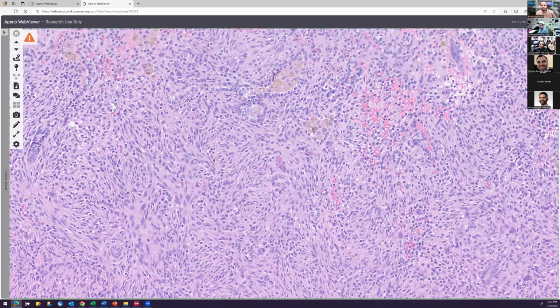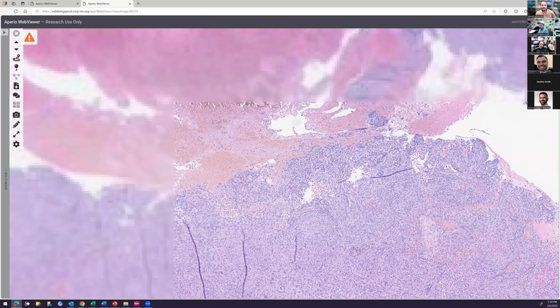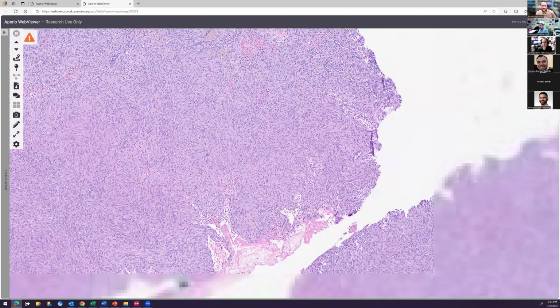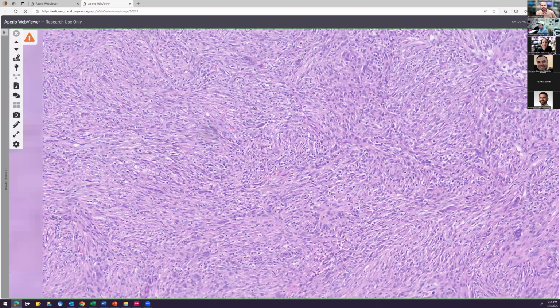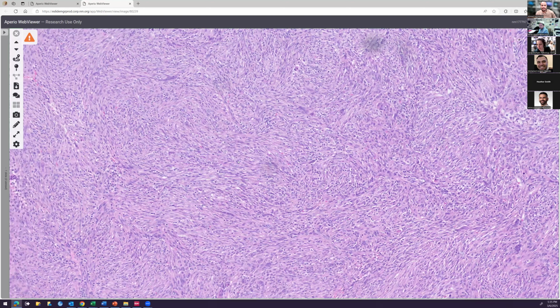This one is actually metastatic to the lung, but it is kind of a difficult tumor to diagnose sometimes. What really helps here is having some molecular testing, just to make sure you're not missing some other spindle cell sarcoma. It also occasionally helps to see some background histiocytic differentiation. This one still has some giant cells here and there. Cellular fibrous histiocytomas are important to note because they do have a higher recurrence risk, but generally with complete excision, they do well. Cool. Any questions about CFH?